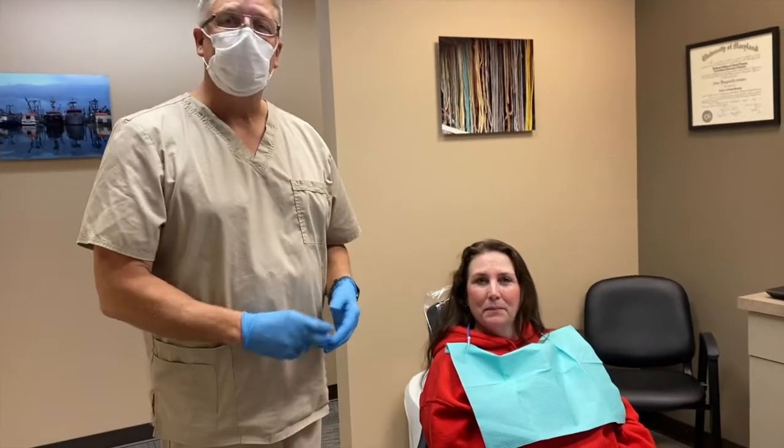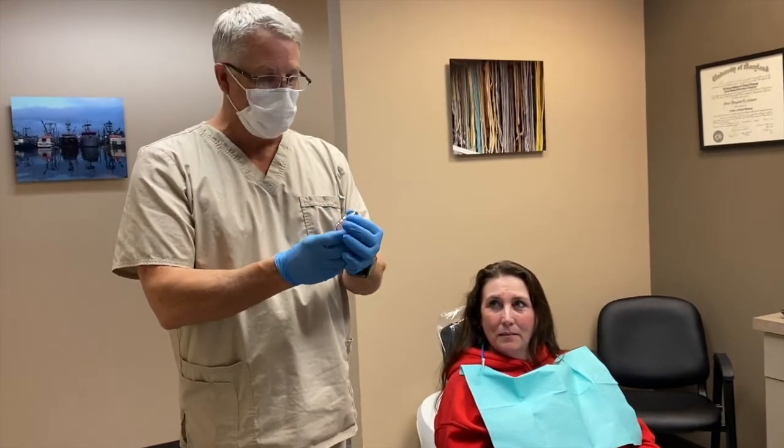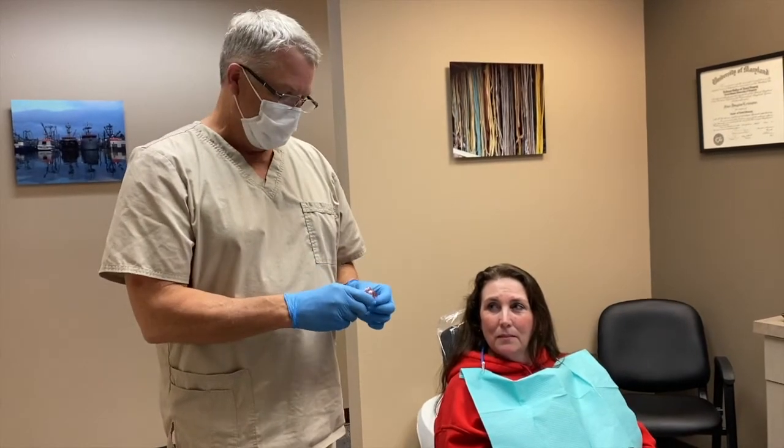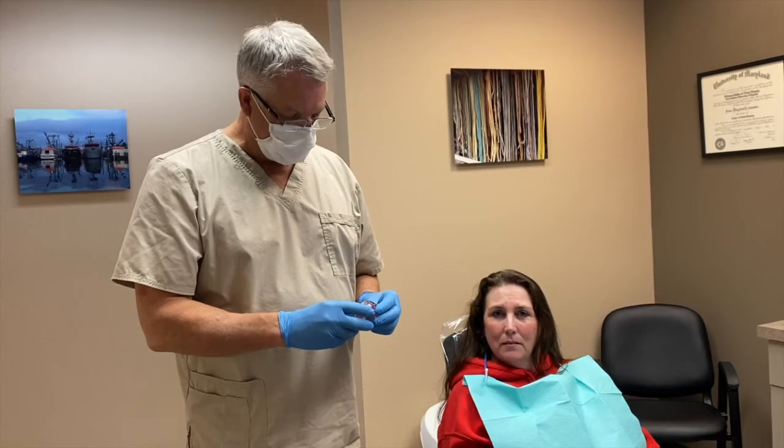This is our patient Judy and today we are delivering for her the Somnomed Herbst Advance Elite Appliance. This appliance is fabricated from a scan so it's going to be very accurate.